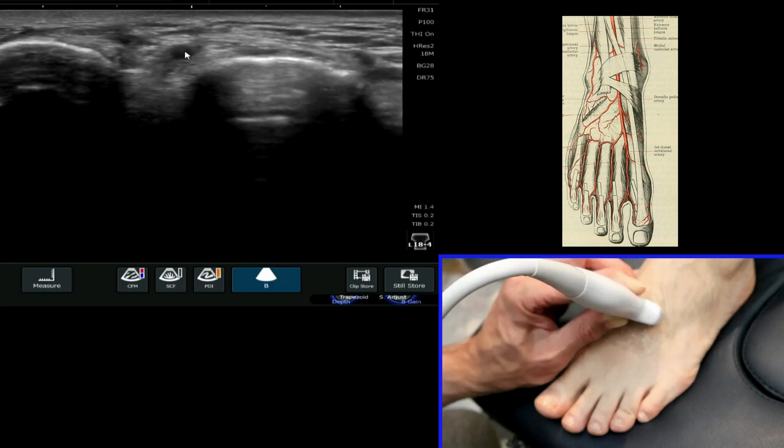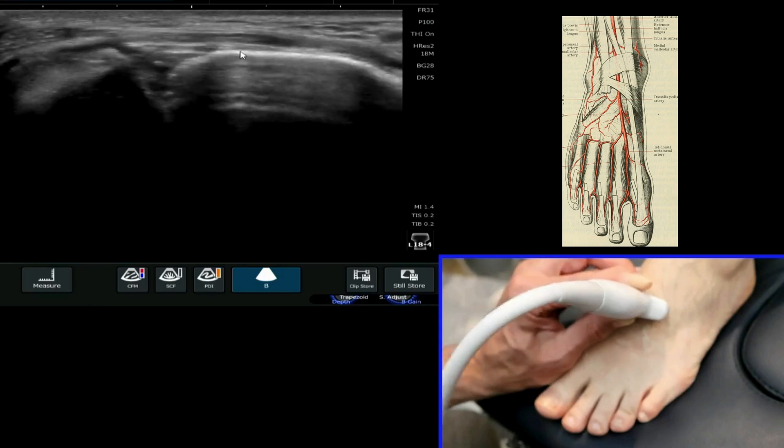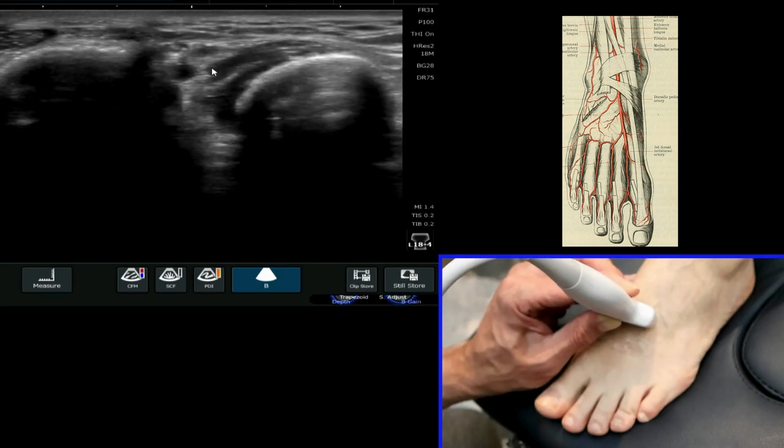Be mindful, as I said earlier — this sits right up in the area where you might be considering doing your tarsometatarsal joint injections for osteoarthritis. You've got to be very aware of where it sits.